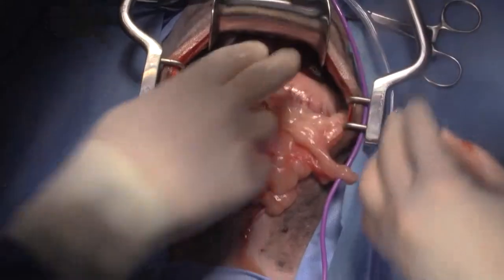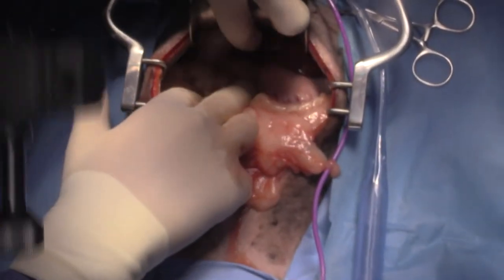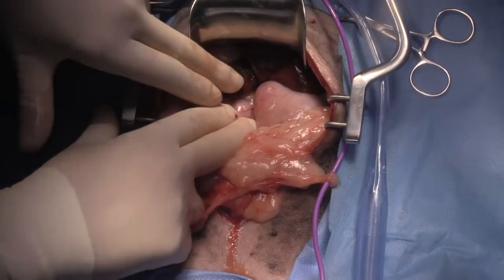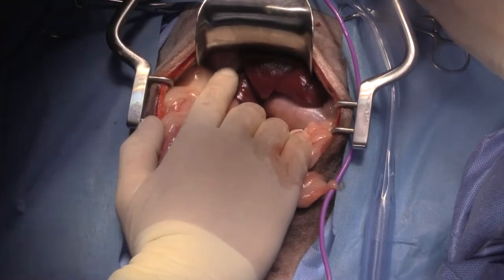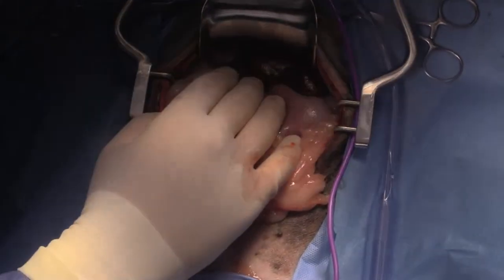Okay, so Jeff's going to just pull up on that for me. So you can see our gallbladder in here. Can you guys see that in there? I'll try to position the camera for this case so we can see the gallbladder readily. The gallbladder is just up here. It's still not the best visualization with the lighting that we've got. We'll try and get a bit better lighting.